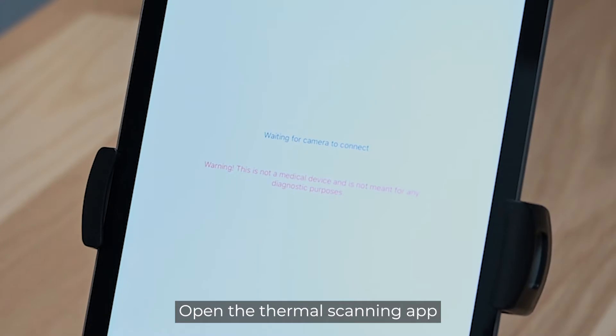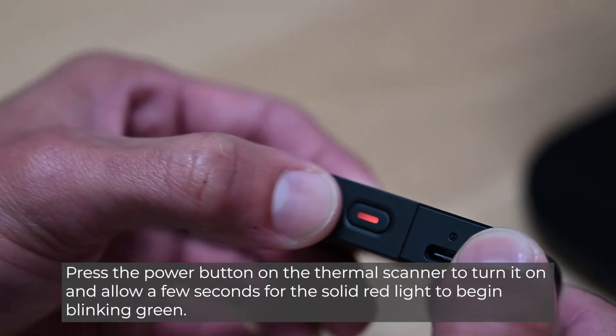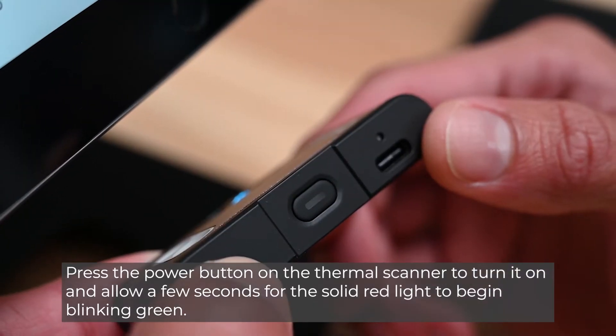Open the thermal scanning app. Press the power button on the thermal scanner to turn it on and allow a few seconds for the solid red light to begin blinking green.